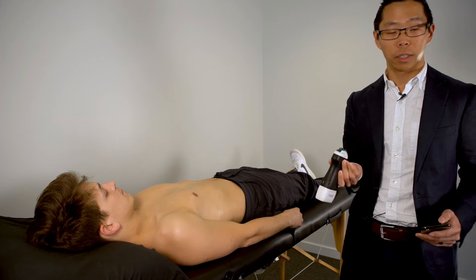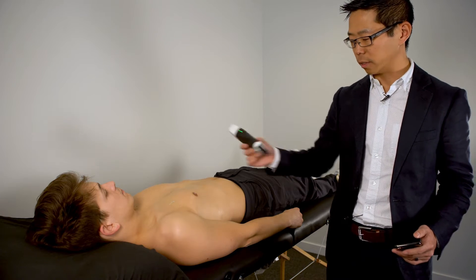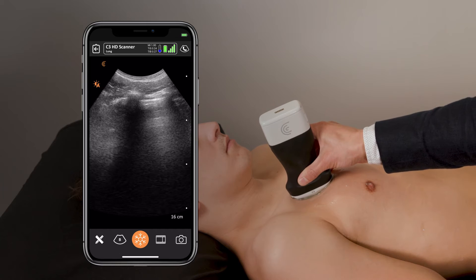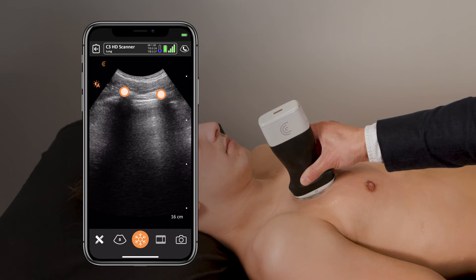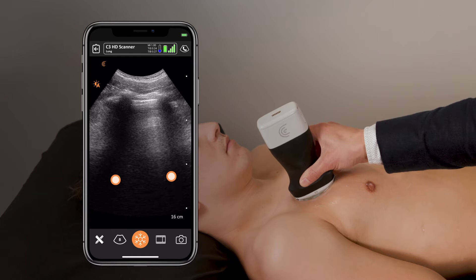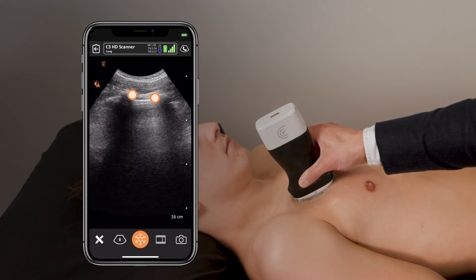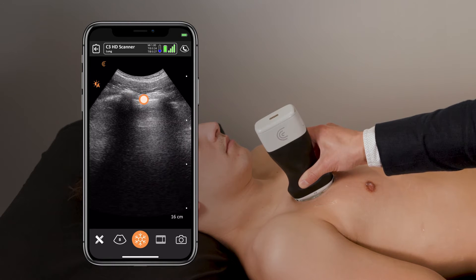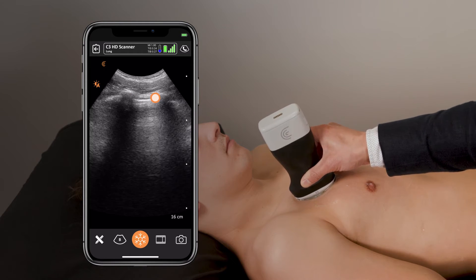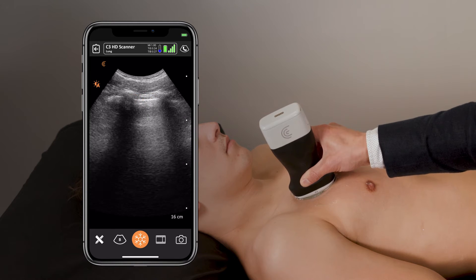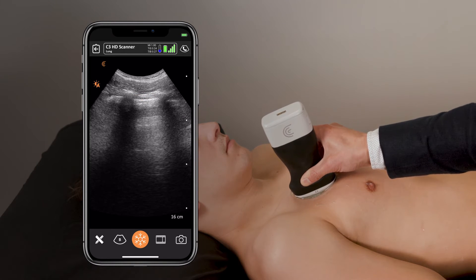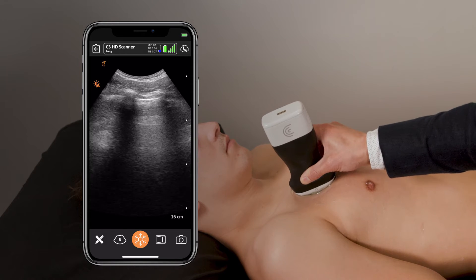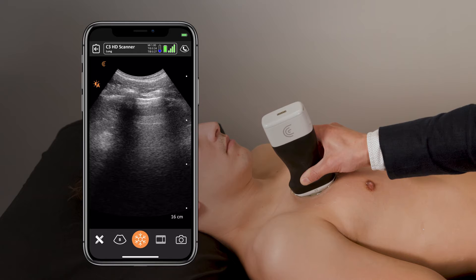Place the ultrasound probe with the marker pointed upwards in a vertical position in the midclavicular line. Our landmarks here are the ribs, which are hyperechoic with black shadowing behind — bright and white with black shadowing. We're interested in the bright hyperechoic pleural line in between, which will have a shimmering movement as we visualize it. Ensure scanning is performed at a perpendicular angle to the pleural line to best visualize it.